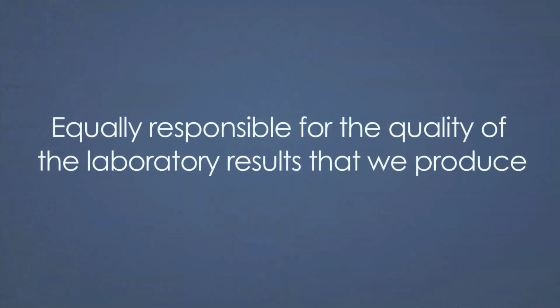Every day in clinical laboratories, our primary concern is the welfare of our patients, and we are reporting very technical information that is essential for modern healthcare. So we're really concerned, and we're of course equally responsible for the quality of the laboratory results that we produce. If our calibration system is wrong, our patient results are going to be wrong, and that will have negative consequences, or at least the potential for negative consequences for patient care, because physicians trust the labs to produce reliable and accurate results. So calibration verification and linearity are two separate assessments of laboratory performance.